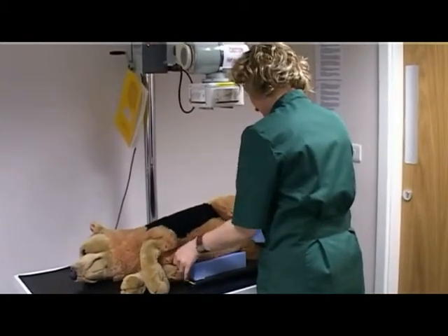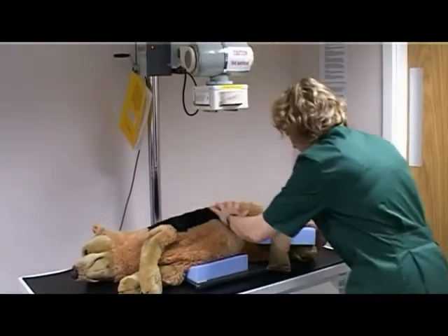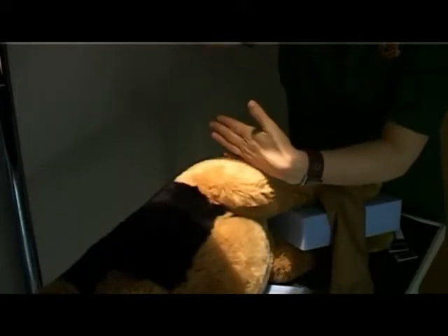Line the tube head so that the primary beam is positioned over the caudal abdomen and within the cassette. Centre the primary beam over the caudal abdomen. Collimate cranially to include the umbilicus, caudally to include the ischium, and ventrally and dorsally to include the skin surfaces.